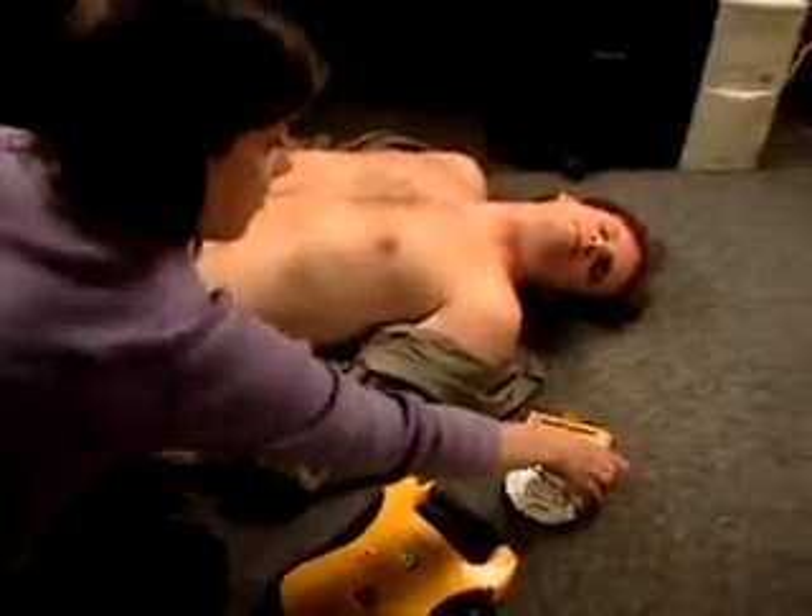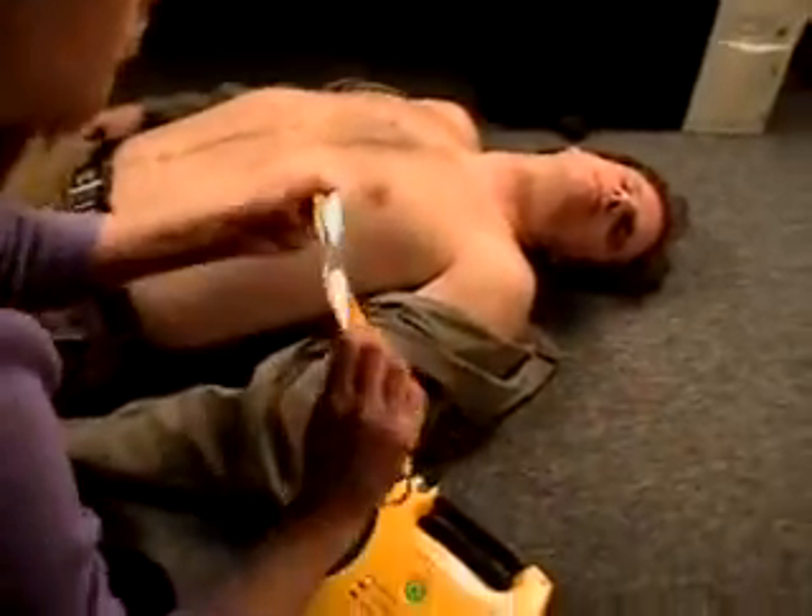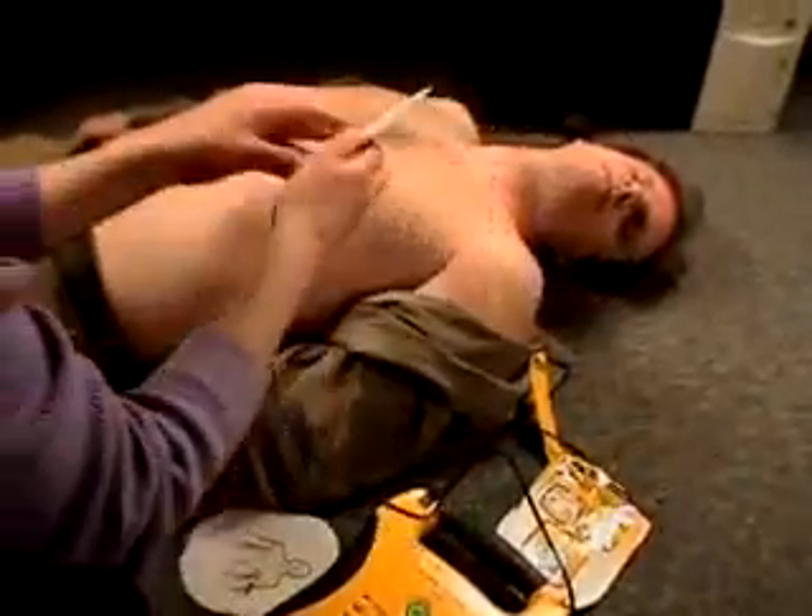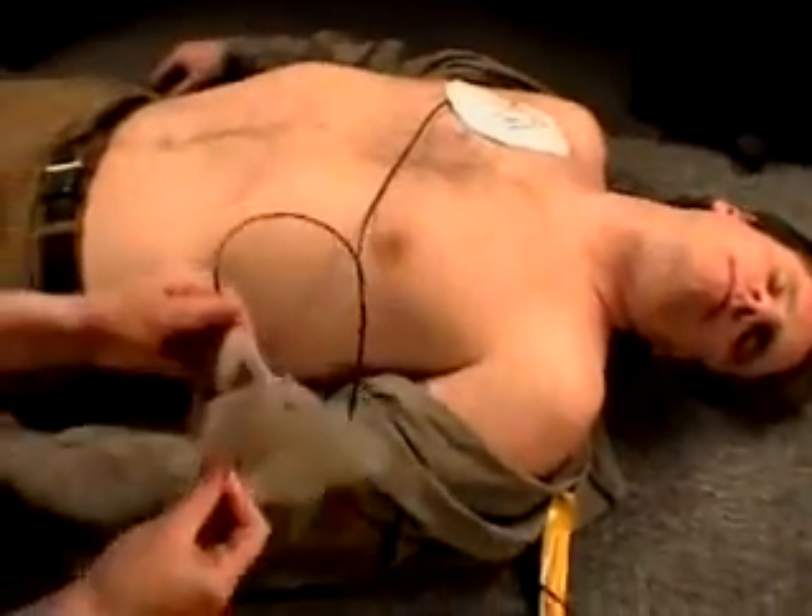Apply pads to the patient's bare chest. The Lifeline AED is designed to be so simple to use that virtually anyone can save a life.